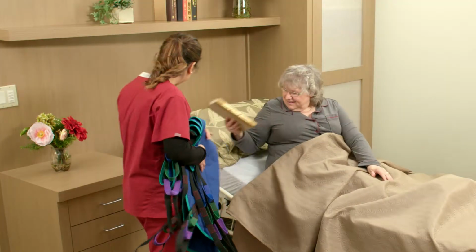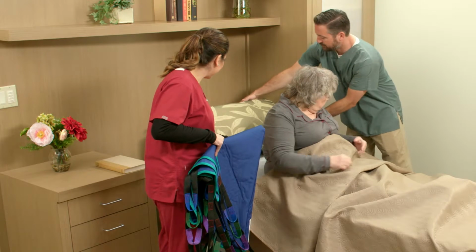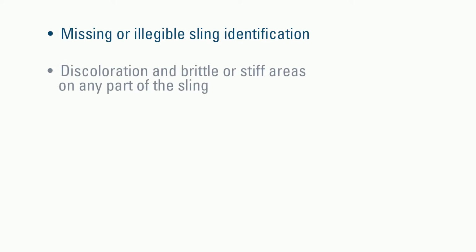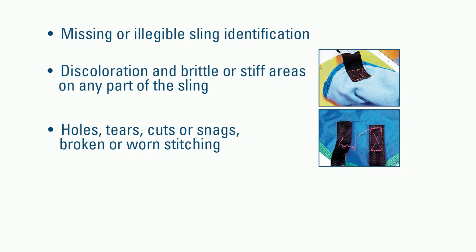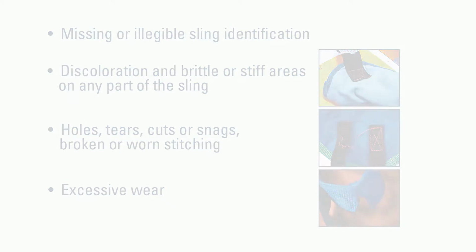Before you start, please be sure you have the proper sized sling for the resident. Staff should thoroughly inspect the sling for damage or deterioration. Items to look for include missing or illegible sling identification, discoloration and brittle or stiff areas on any part of the sling, holes, tears, cuts, or snags, broken or worn stitching, excessive wear. Where any such damage or deterioration is present, do not use and remove the sling or attachment from service immediately.